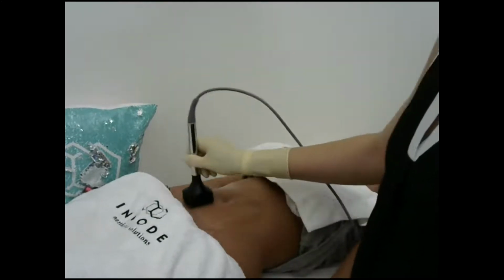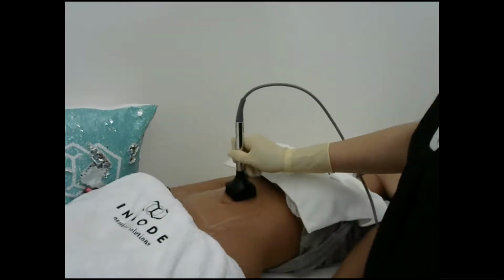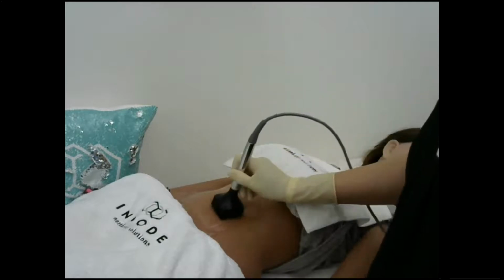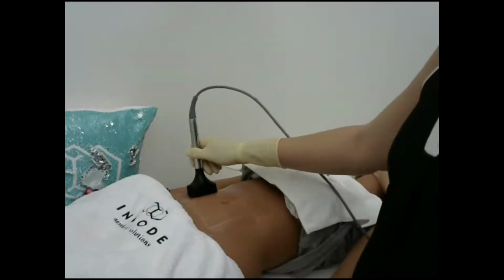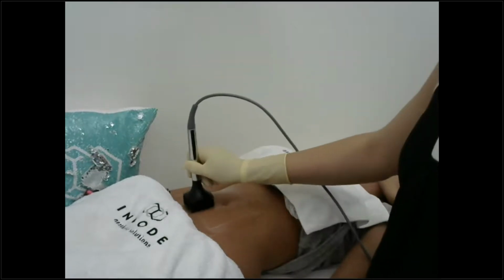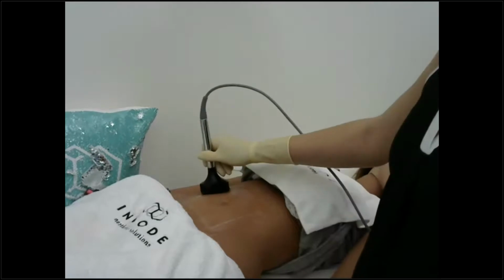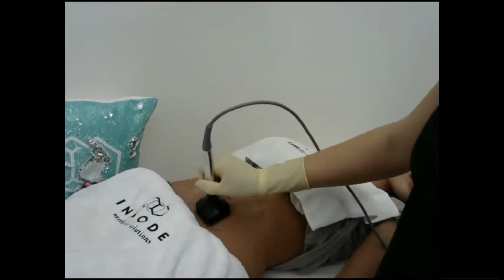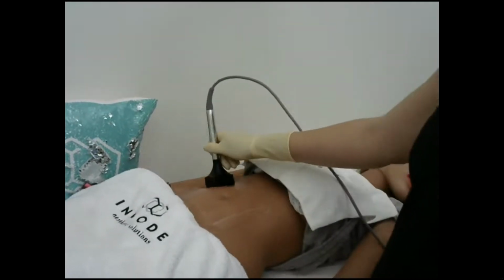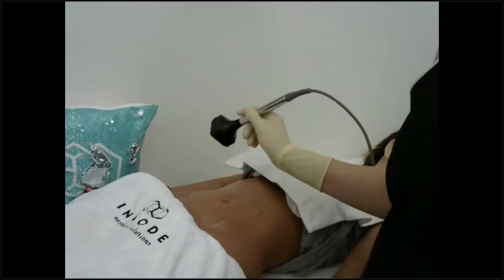And I remind you, if the patient is complaining of a too hot sensation for some reason, there are things to do before I reduce the cutoff temperature. So first, I move faster. Second, I enlarge the treatment zone. Third, I reduce the power, and only then would I actually reduce the cutoff temperature.